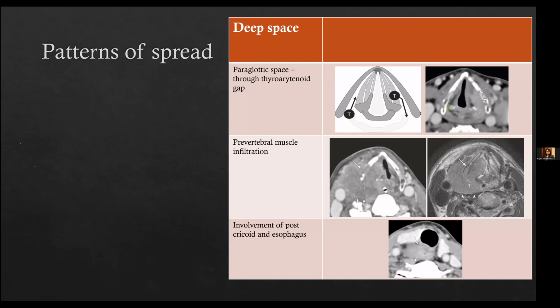Right. I think there is a long question. Do we use ADC values in T2WI or diffusion-weighted images for hypopharyngeal lesions, due to the effacement and the possible difficulty in imaging early hypopharyngeal lesions or disease recurrence? Or does it help in NI-RADS scoring as a troubleshooter?